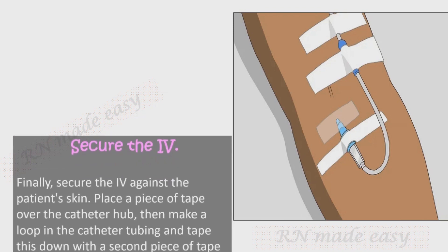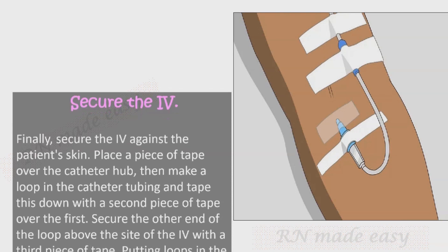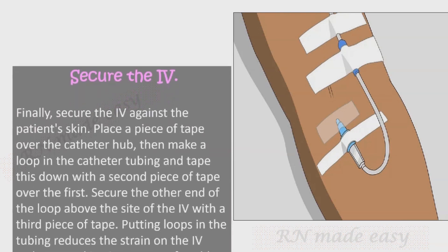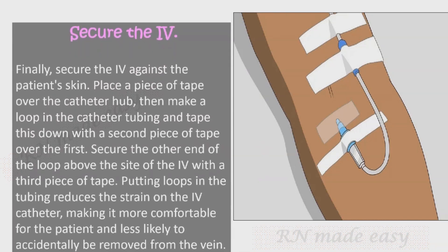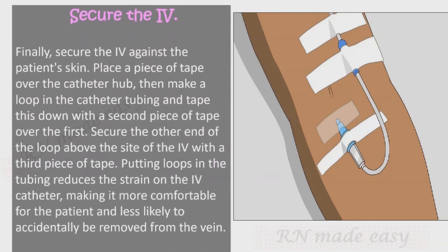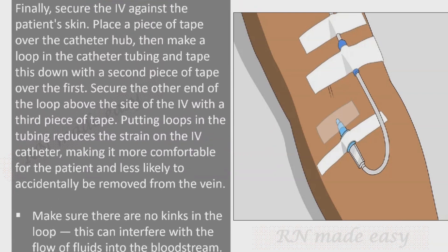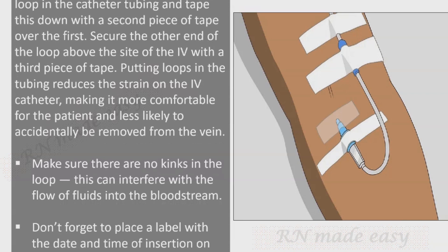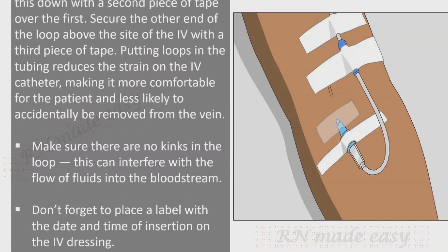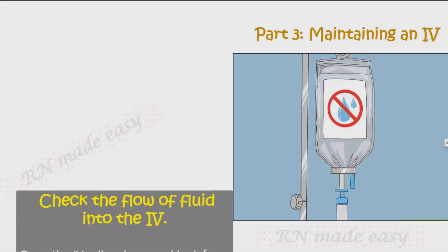Secure the IV against the patient's skin. Place a piece of tape over the catheter hub, then make a loop in the catheter tubing and tape it down with a second piece of tape over the first. Secure the other end of the loop above the IV site with a third piece of tape. Putting loops in the tubing reduces strain on the IV catheter, making it more comfortable and less likely to be accidentally removed. Make sure there are no kinks in the loop, as these can interfere with fluid flow. Label the IV dressing with the date and time of insertion.